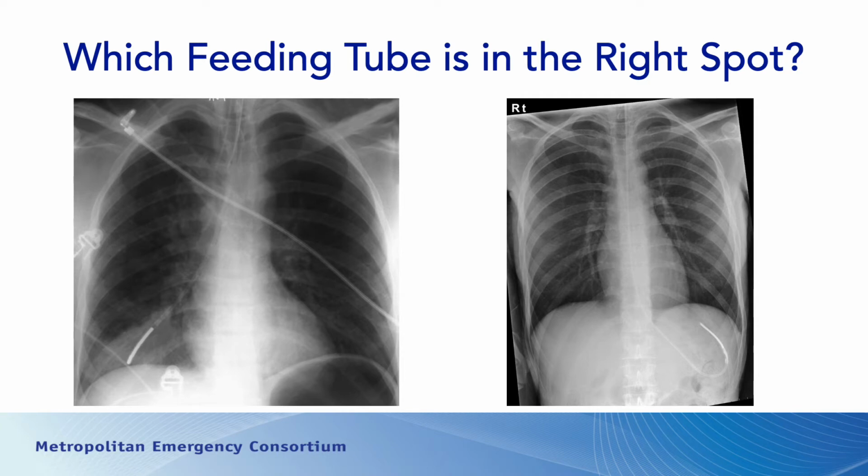The interesting thing to me is it looks like the patient has an endotracheal tube in place. If you look up toward the top, you see two white lines that are parallel. That's either an endotracheal tube or a tracheostomy tube. Either way, you kind of wonder how that feeding tube got down there past the tube that may already be in place. Makes me wonder if the feeding tube went in, the patient developed complications, and then had to be intubated.